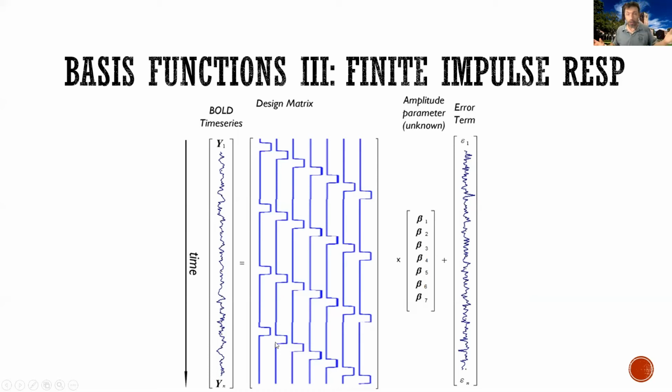So now, essentially what we're doing is we're averaging every individual volume. And what we end up with is known as a tent function, right? Every volume has its own amplitude. And then you can connect it to get the response. And I'll show that in a second.